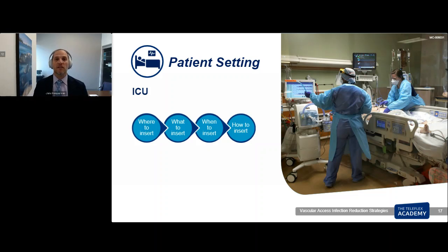And they can safely have their vasopressor administered through a peripheral IV. And maybe if that vasopressor dose doesn't decrease as I was hoping, or other things happen, then I can place the central line when I know the patient really needs it.